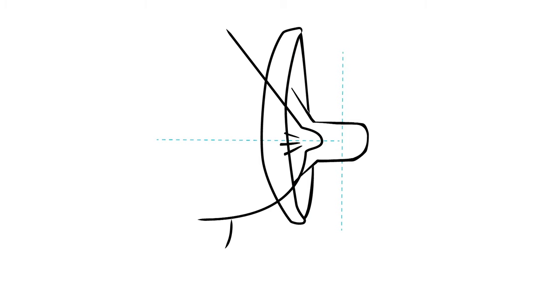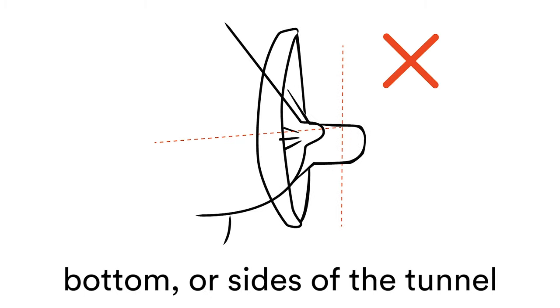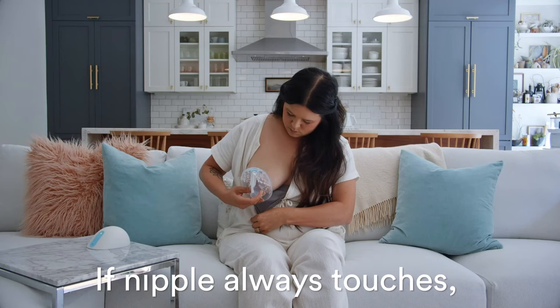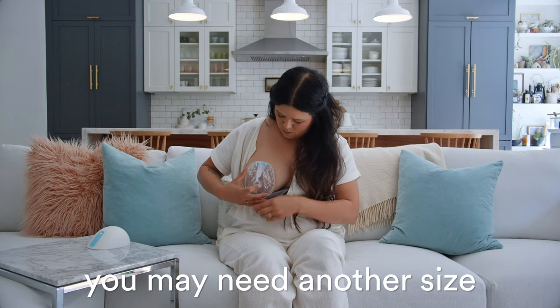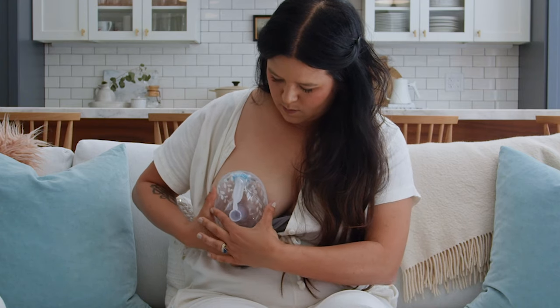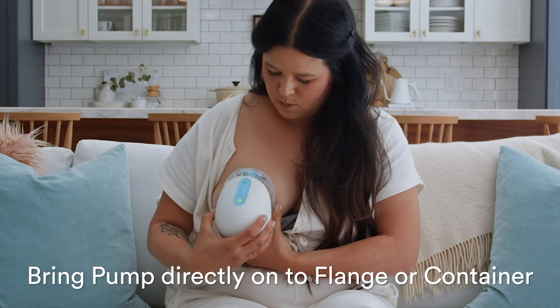It is important that your nipple is not touching the top, bottom, or sides of the flange or insert tunnel. If there is no position where your nipple is not touching, then you may need another size. Once your nipple is centered, hold the flange or container and bring the pump directly on until it connects.